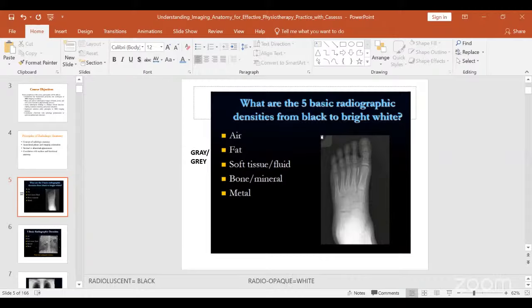Some books don't put this hyphen, okay? So radio-opaque. Are we together? Now, in between them, there are extremely white areas on the radiograph, and also there are extremely dark areas on the radiograph. So we have a trade-off.